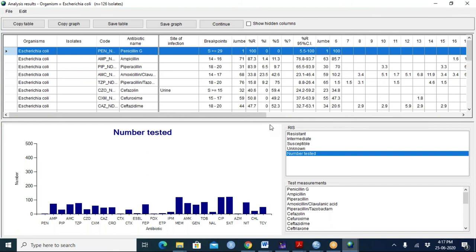So in the future, I'm hoping that we can pick a certain minimum standard that is tested consistently on every isolate. Does that make sense? Yeah. It's good for statistics, but it's also good for patient care. It's good if the doctors know they're going to get the same core set throughout the country of the most common things that they should have. Of course, if the labs want to do more testing, that's fine. But they should at least do the minimum.